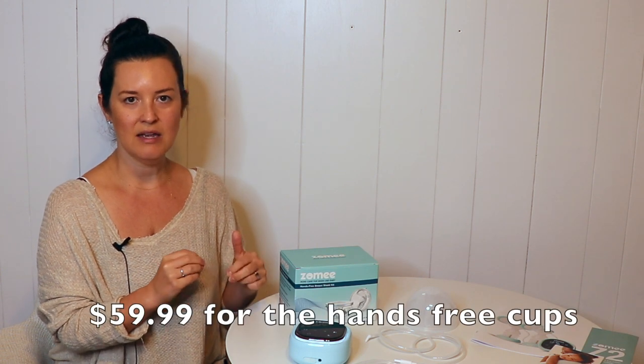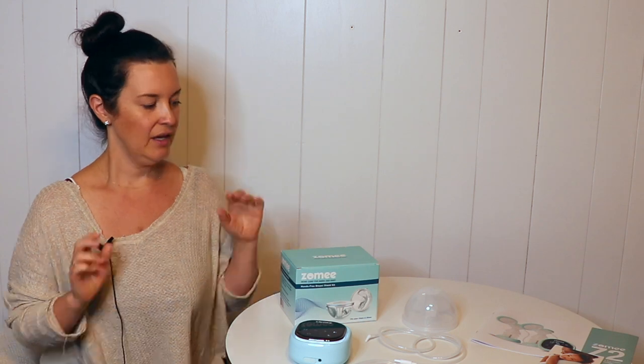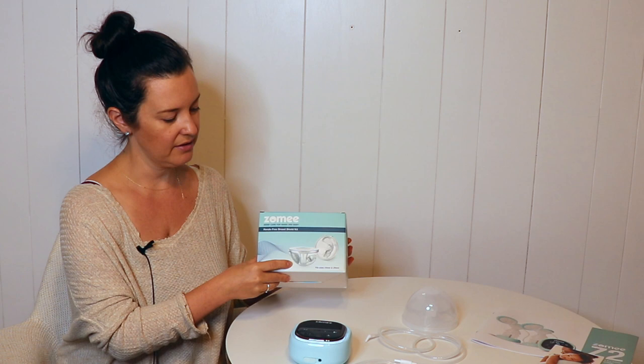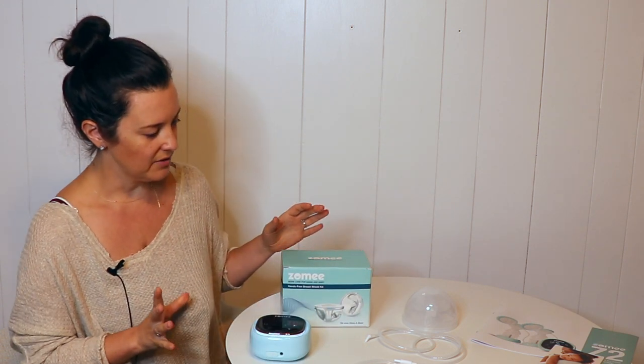The cups are an add-on so they don't come with the pump itself. The current cost on their website is $59.99. I will leave a discount code in the comments down below. Here on the table you can see everything that comes in this box with the collection cups — besides the pump itself, which is sold separately.